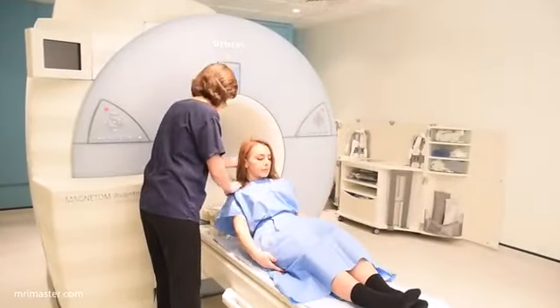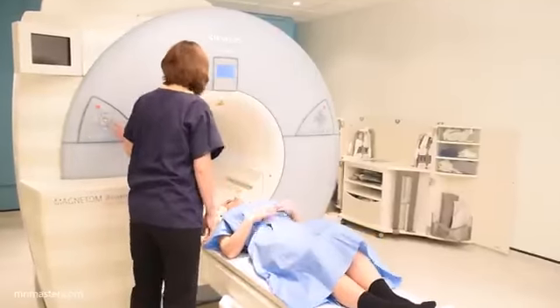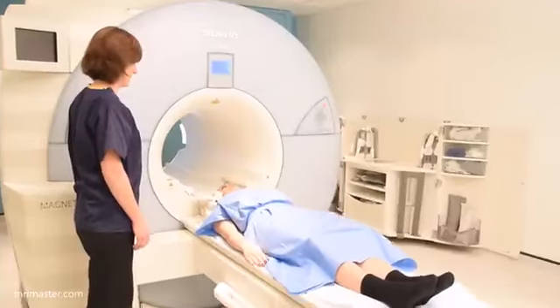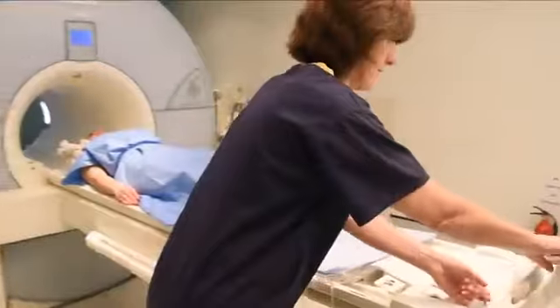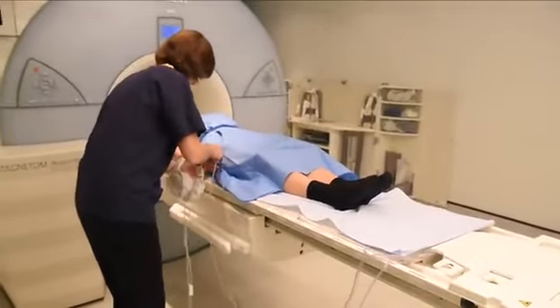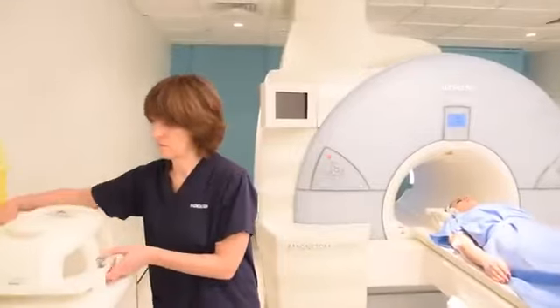After carrying out your safety checks, bring the patient into the scanner room. Help them to lie supine on the bed with their head in the head coil. Provide the patient with an emergency buzzer and make sure they know how to use it. Provide headphones to protect the patient's ears.